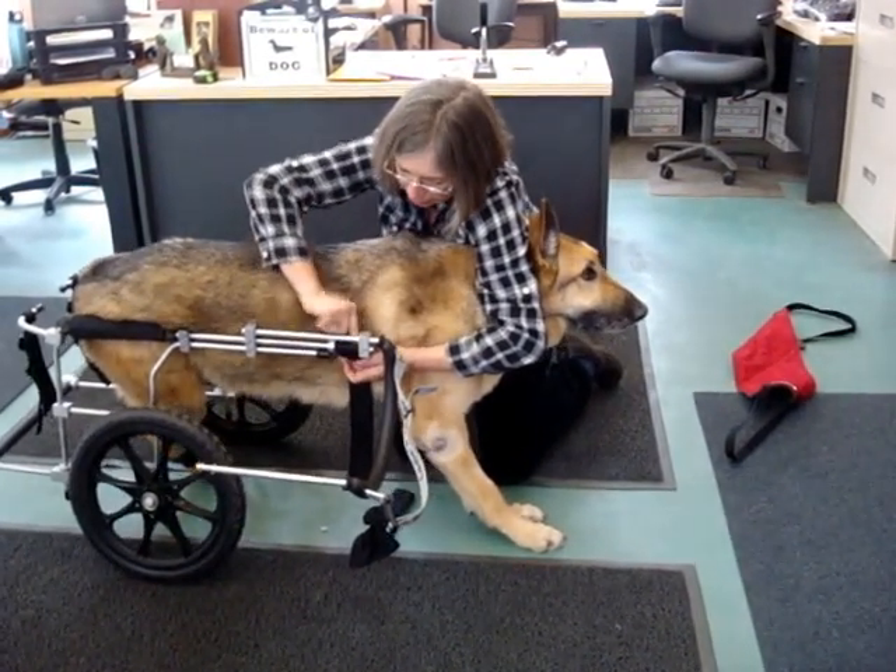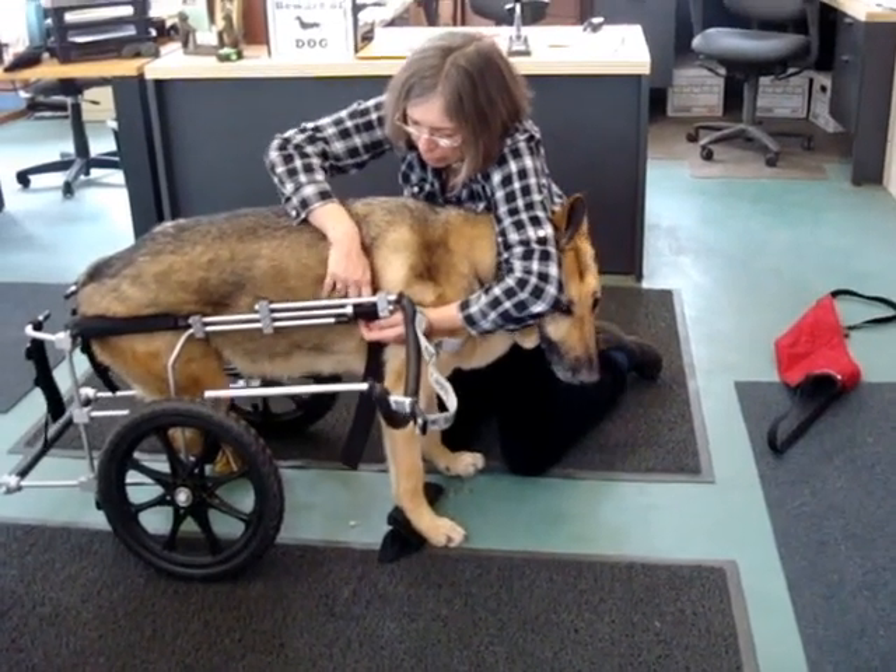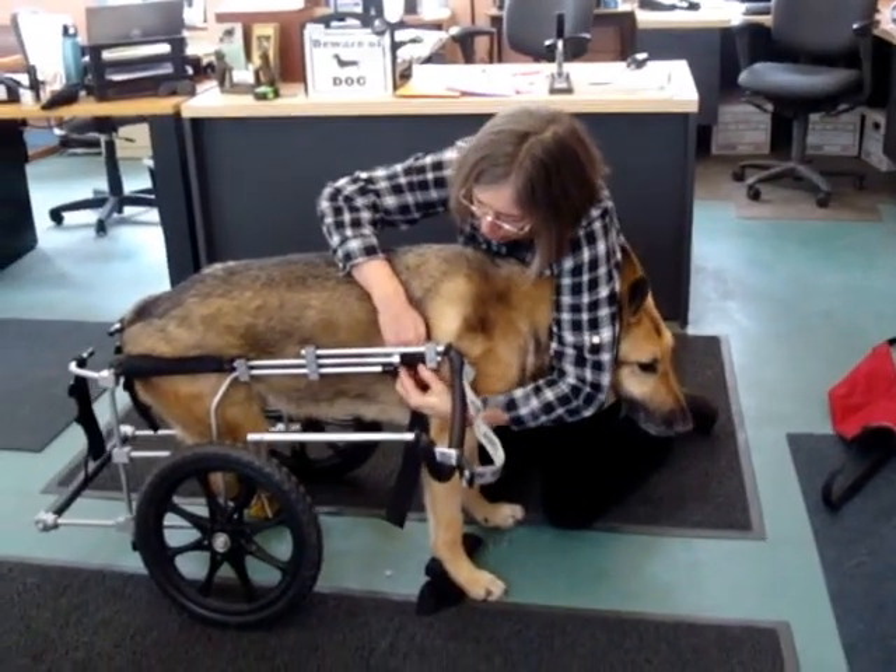I'm going to get this little belt up on the wall here. It's all in place, and I'm having a hard time getting it all.